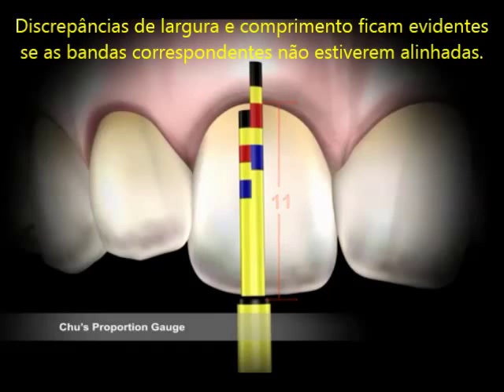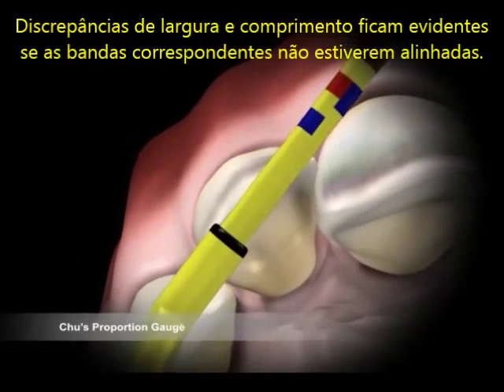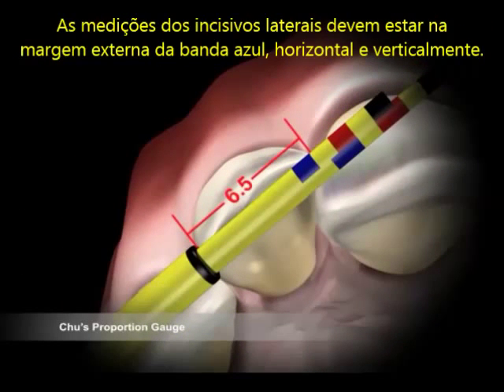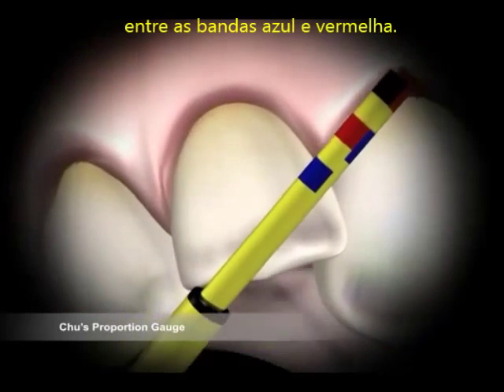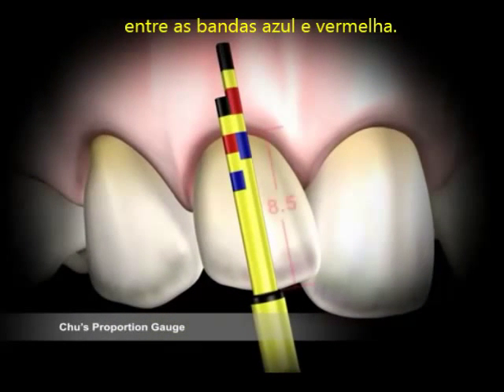Width and length discrepancies are evident if the corresponding color bands do not align. Lateral incisor measurements should be at the outer margin of the blue bands both horizontally and vertically. Canine measurements should be at the outer margin of the intermediate yellow bands between the blue and red bands.